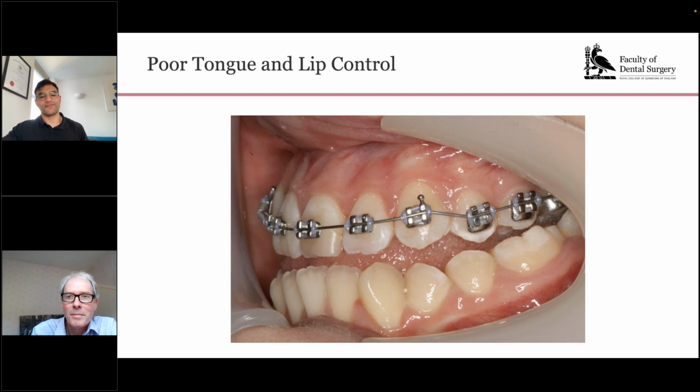Okay. Noor Nadia Zakaria asks, do you prefer using the cheek retractor or buccal mirror for buccal shots? I use the cheek retractor, simply because it's easier to get the assistant to get it right every time. And the other thing I like to do is, because taking photographs is an additional thing, right? It's an additional procedure that you have to do for the patient.